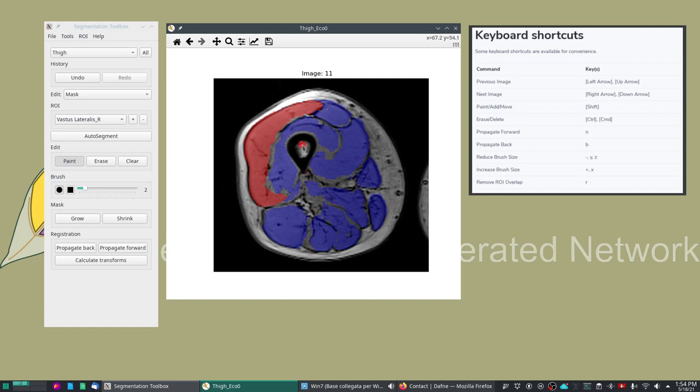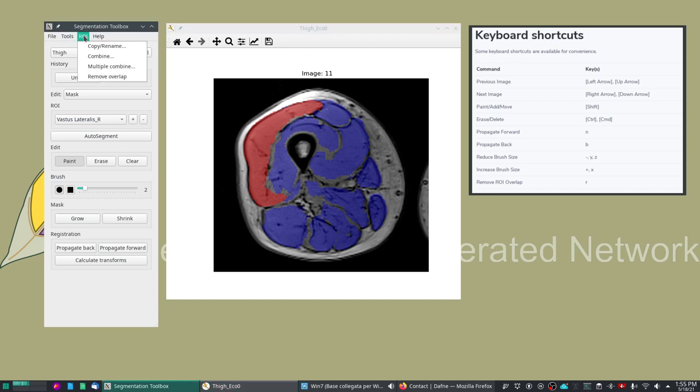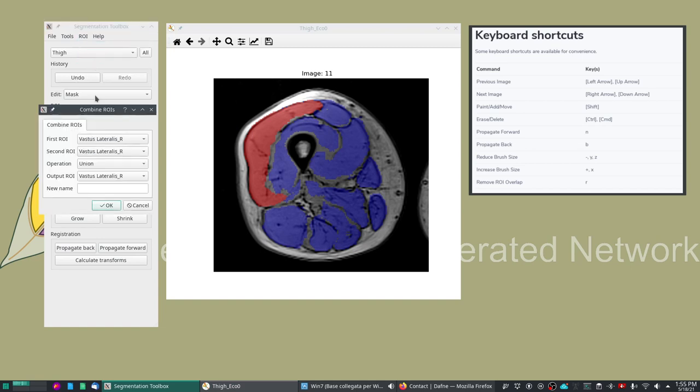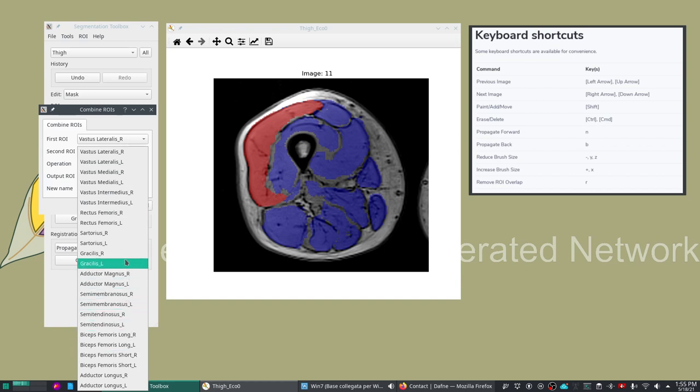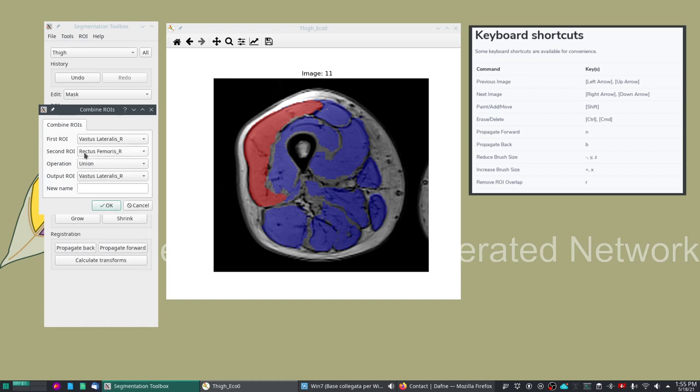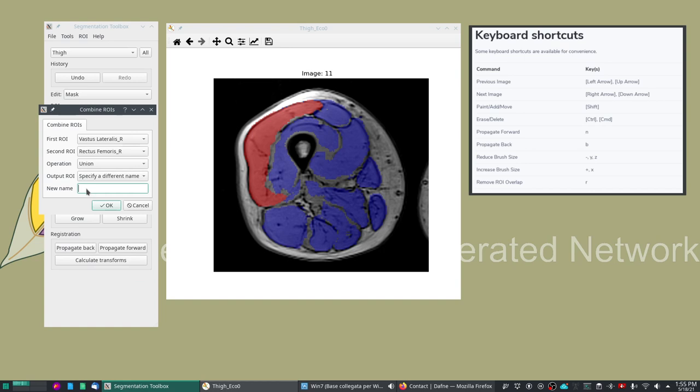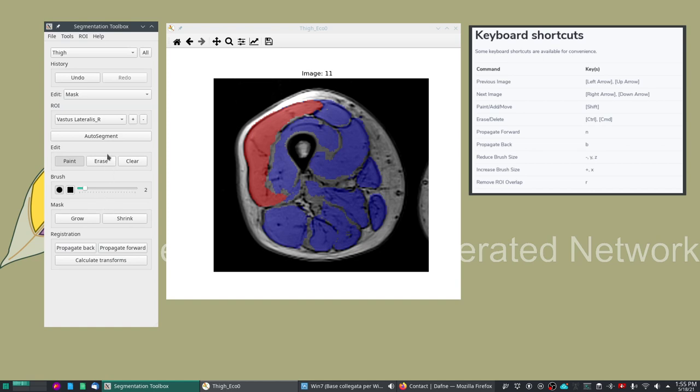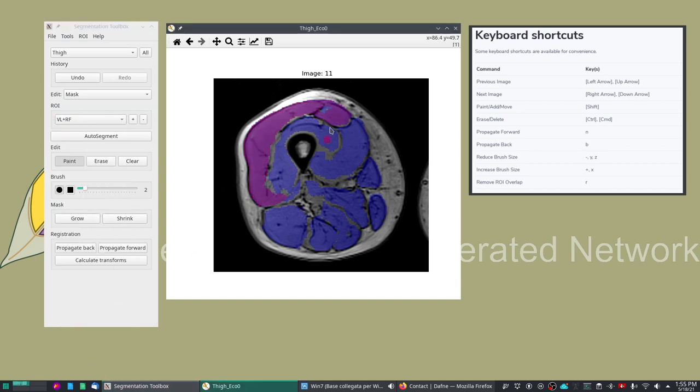You can also do some boolean operations on the ROIs. For example, you can combine the vastus lateralis with the rectus femoris. In this case it's the right. We do a union and let's put a different name, VL plus RF, and this will be the combined ROI that is defined with the union.